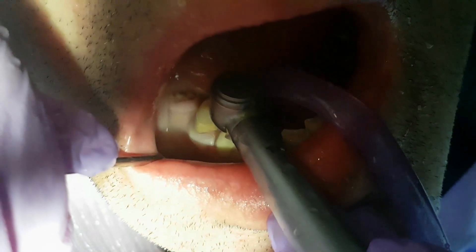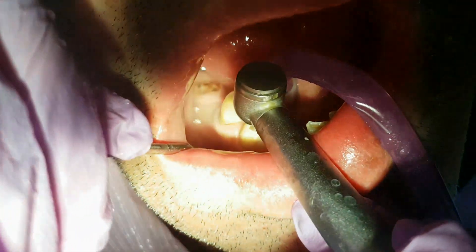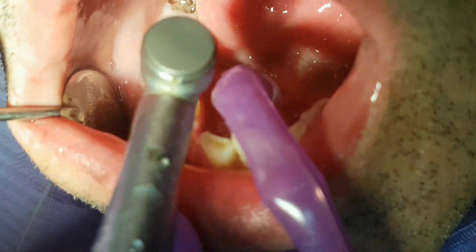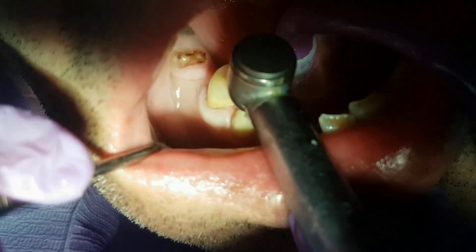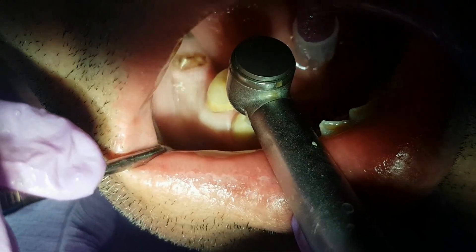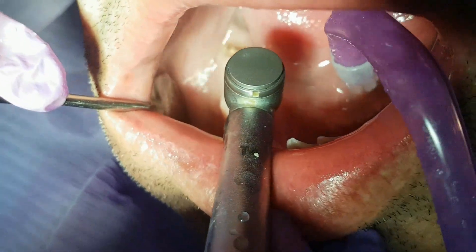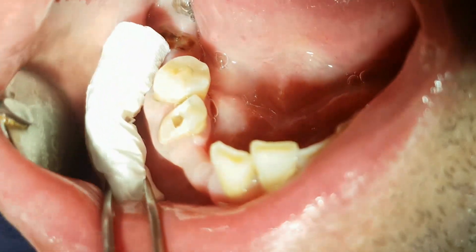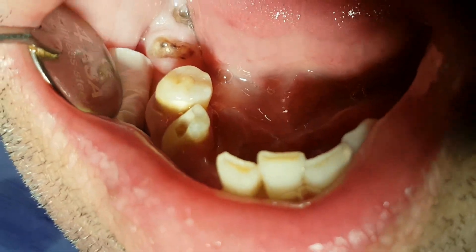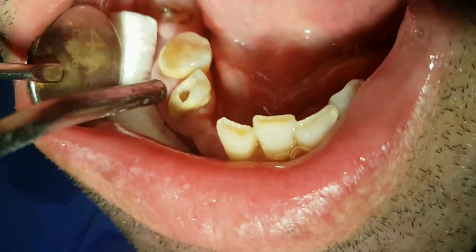We go in through the whole depth of the tooth until we get to the openings of the root canals. We apply a tampon and dry out the cavity.